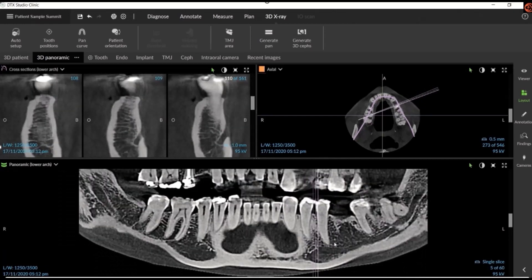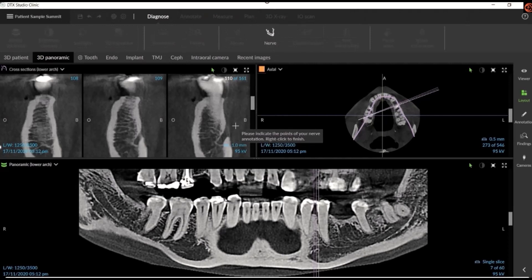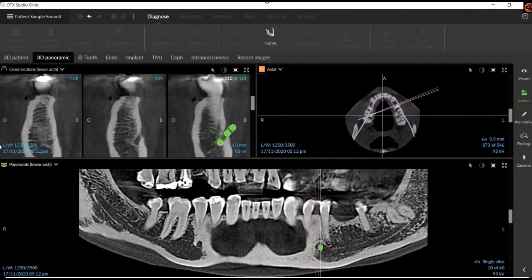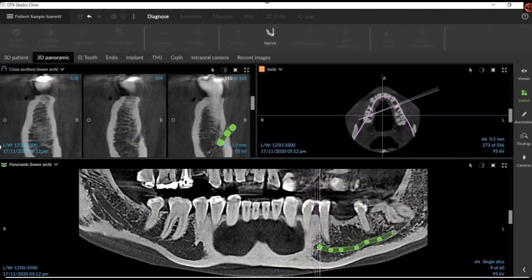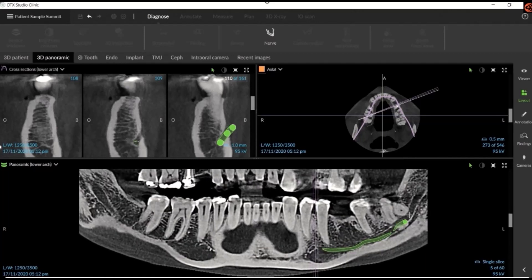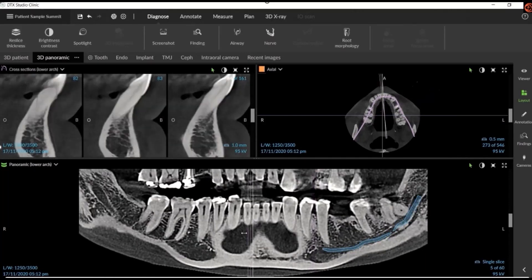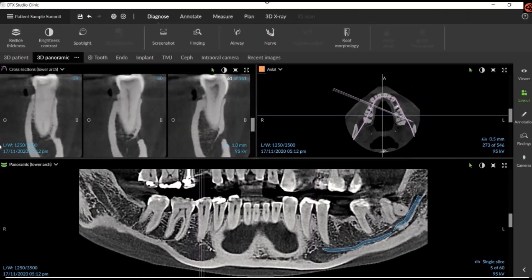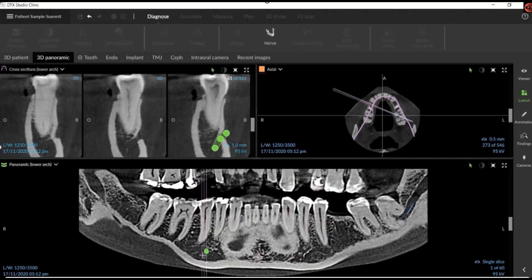In the cross sections in the upper left, you'll find the mental foramen. Then you have to trace the nerve from anterior to posterior, then repeat on the opposite side. These steps will typically take in office 15 to 30 minutes per case to complete, depending on the clinician's expertise and the patient's case.